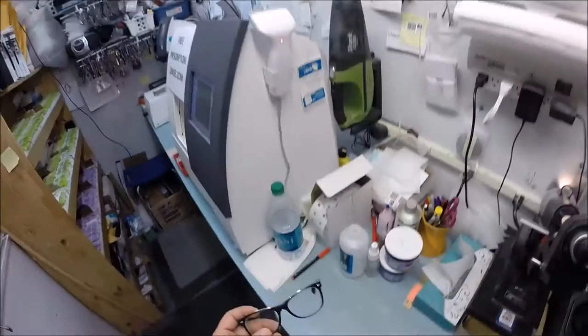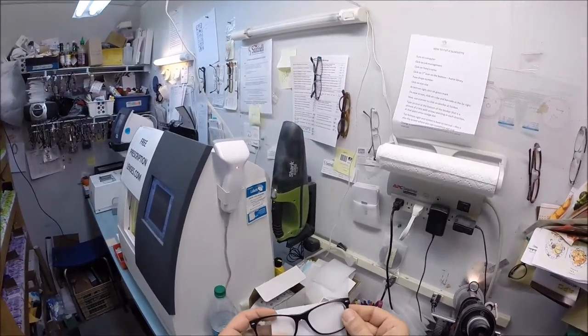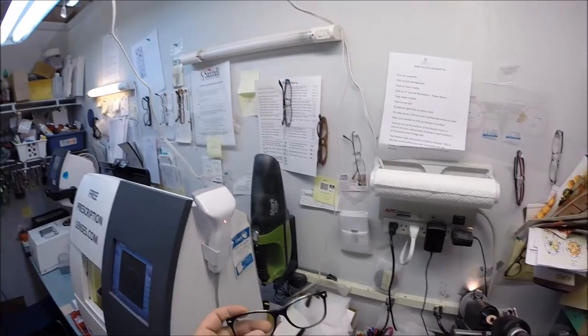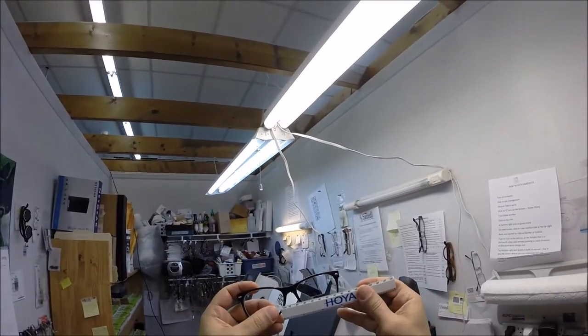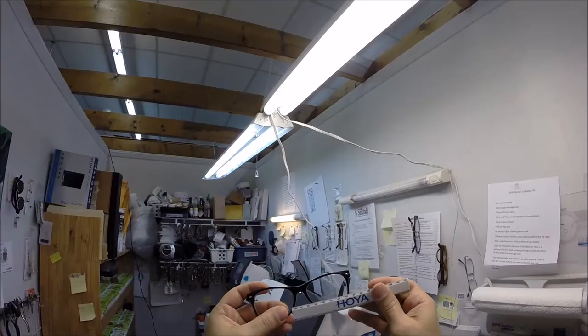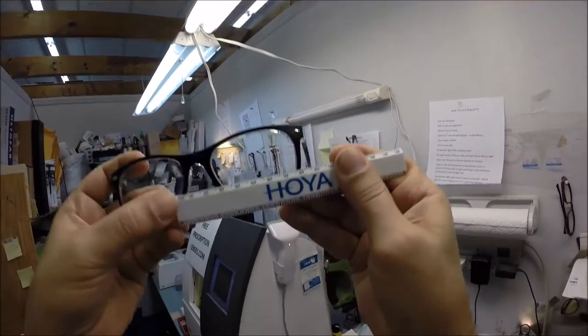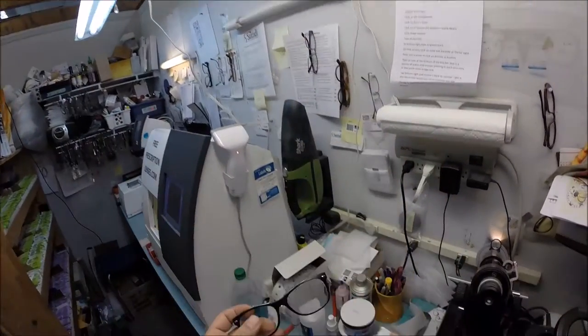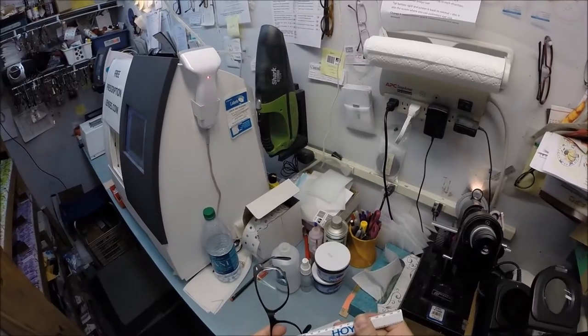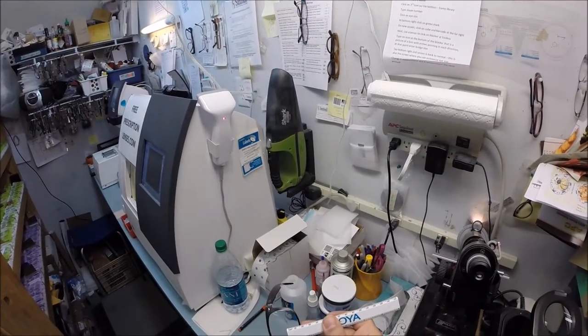Now your pupillary distance is 62. So for a bifocal with the line, I'm going to start at the outside corner and measure to the outside corner of this lens and we're getting 62 millimeters. So that is made perfectly. I do want to check your bifocal height real quickly. Perfect.